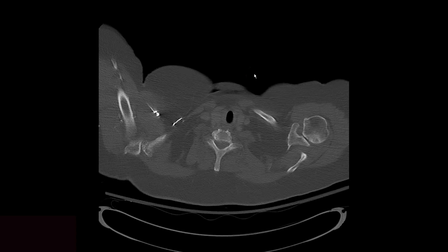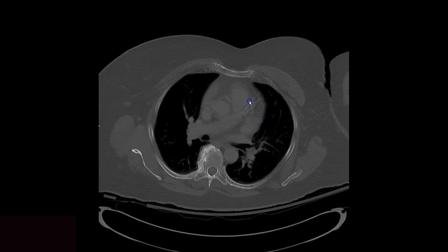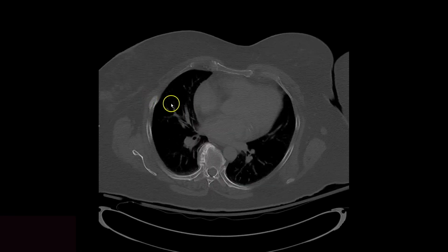So here's a common problem in radiology. You're reading an axial CT of the chest, and as you scroll down, you run across a rib fracture. In radiology, we try to minimize scrolling as much as possible because it leads to carpal tunnel and it just slows you down. But anyways, when you have a fracture here, you can scroll back to the top and count down from the first rib. But just a quick, simple hack is to count from here as you're going up.